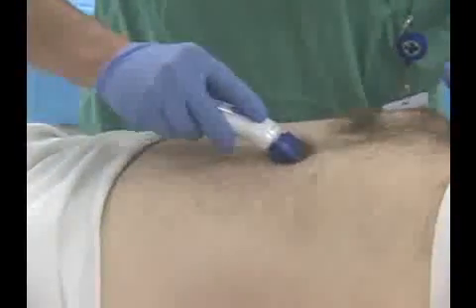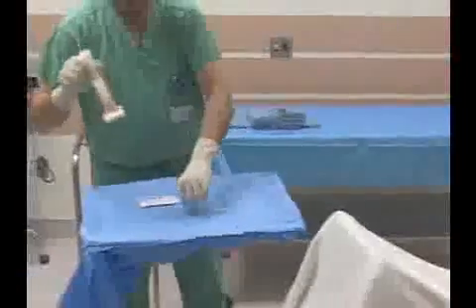Clipping uses an electric razor or hair clipper with a detachable head that can be sanitized between patients. It is less likely to cut the skin but can still pull and cause skin irritation, and it does not fully remove hair at the skin. Whether or not the site is shaved, it must be thoroughly cleaned with an antiseptic solution immediately prior to the surgical procedure.